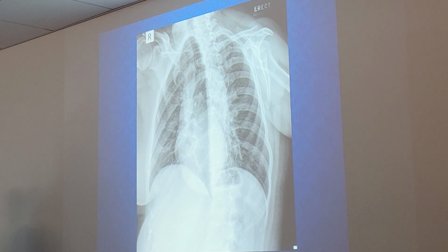I remember saying that you mark the side of interest. Is that not correct? No, he said mark the side that's touching the IR. Yeah, the side that is elongated, that's the side that you mark. No. He said the side that's touching the IR. But if it's the same size, it's elongated. Okay, well, what is it?